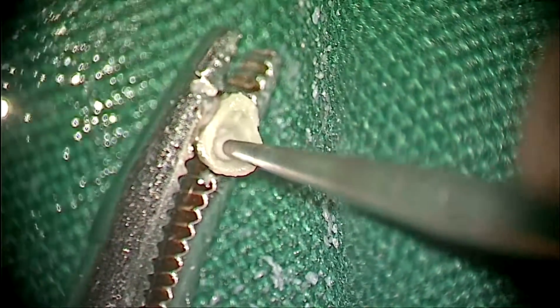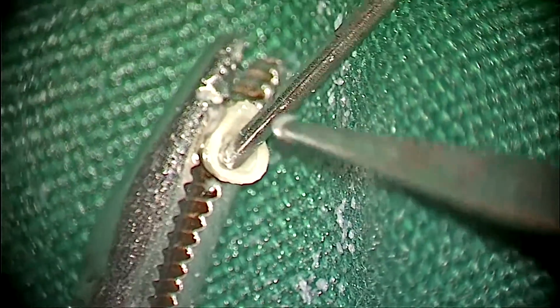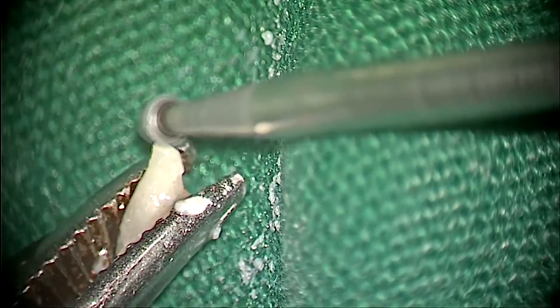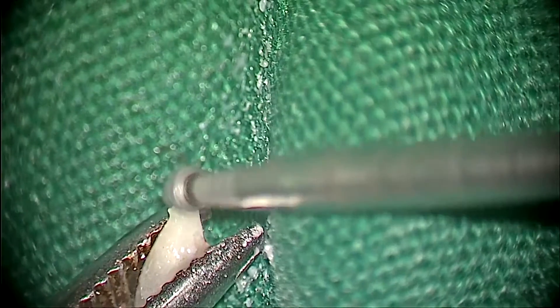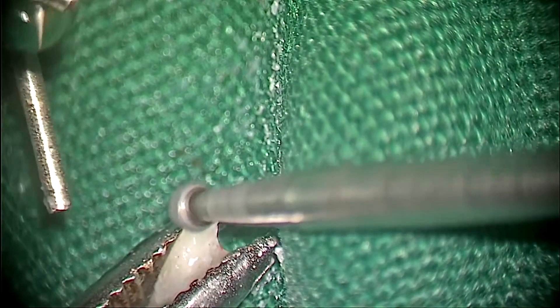The groove was made nice and deep to fit the stapes head. The short process of the incus was shortened and made flat so that it can touch the tympanic membrane.